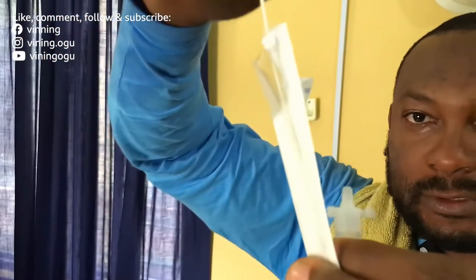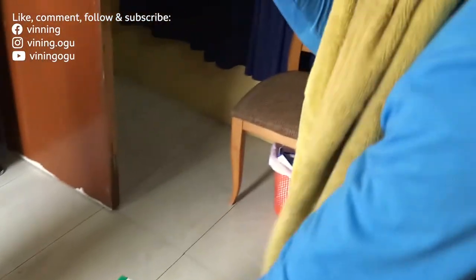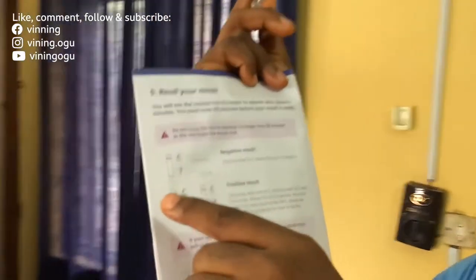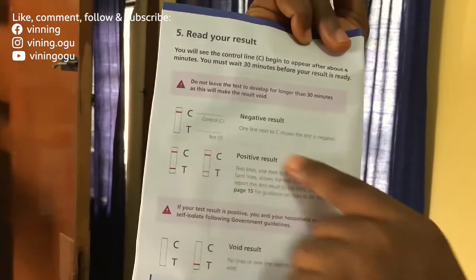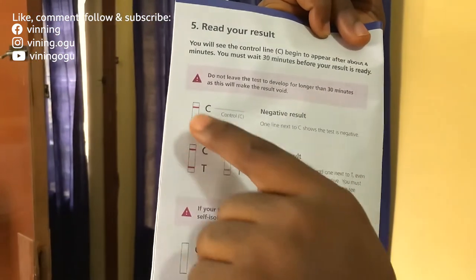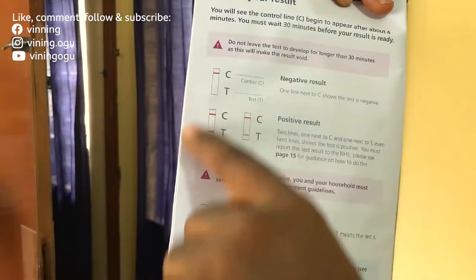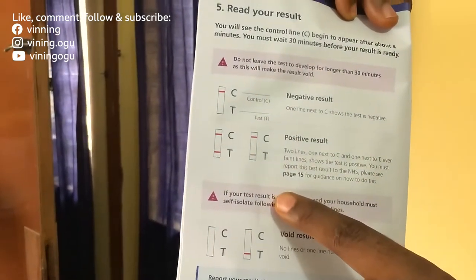This card is the one I've used. I'm going to drop it on the indicator. So if the test is negative, you'll see only one red line on the C. If it's invalid, one red line will be on the T. But if you're positive, you'll have two red lines — one on the C and one on the T. Let's see what Van is going to get.